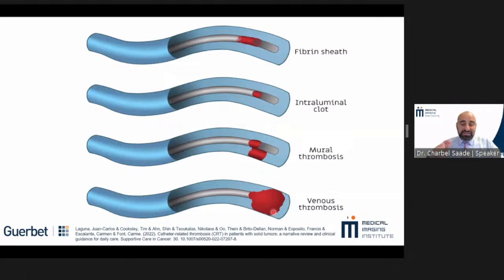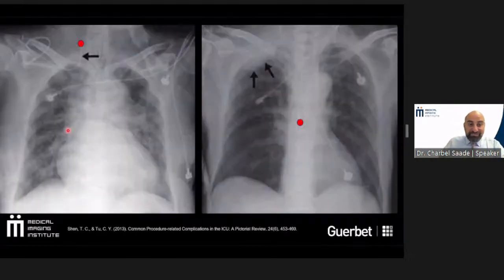Now, this is another risk area when injecting into central lines, and it's important when they get a registered nurse or radiologist that they flush it and they check it, because then they will determine not just on flushing and checking whether it's safe to go ahead or not. But still, once they've done this, it's still not safe because you need to check your topogram. When we come to check the topogram, sometimes they will flush it and central lines and lines, they can move. So look at this one here, it's gone back up the internal jugular vein. So this is a risk. So always check your topograms.